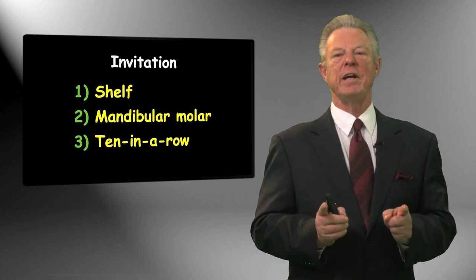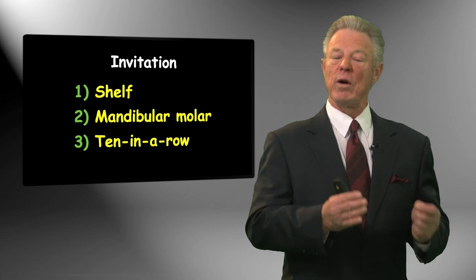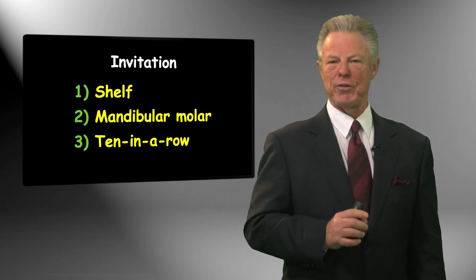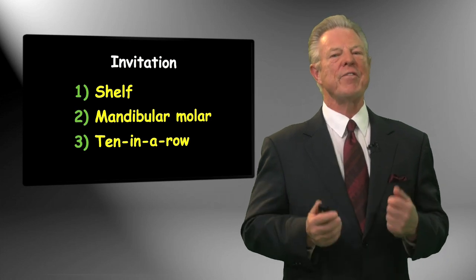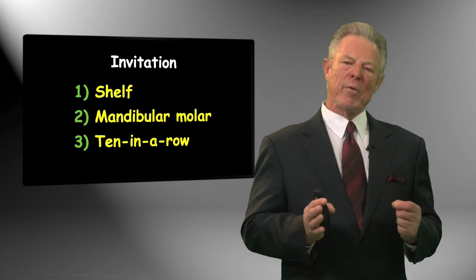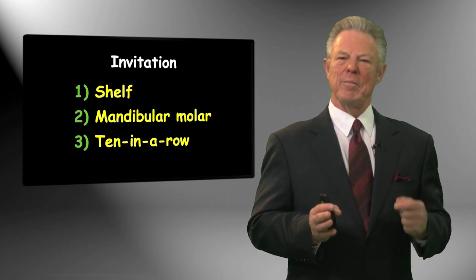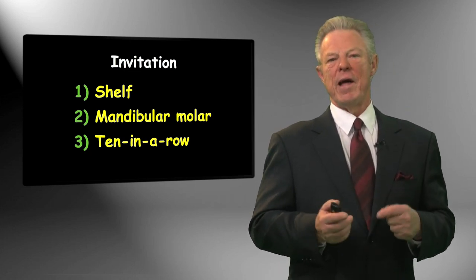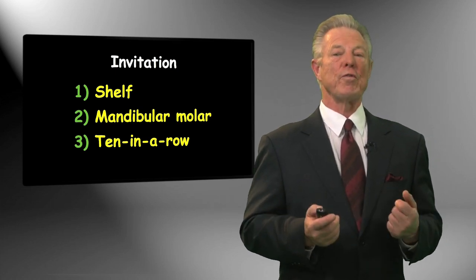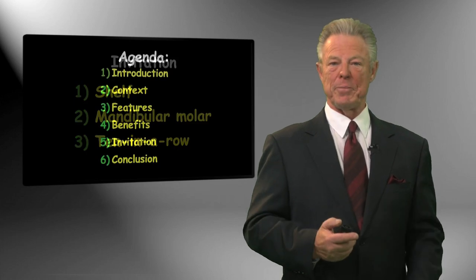And then do 10 in a row with ProTaper Next. Write down your experiences, what worked and what didn't work. You know what? You'll discover the answer for you. And I think that's a valid, honest way of doing it. And remember in the beginning I talked about you want to challenge not just what I'm saying, but what's going on in our own heads. And this is a very valid way to test it, and it's been very useful for me because I've been able to say sometimes I agree and sometimes I don't.